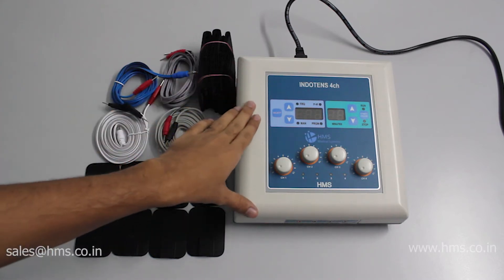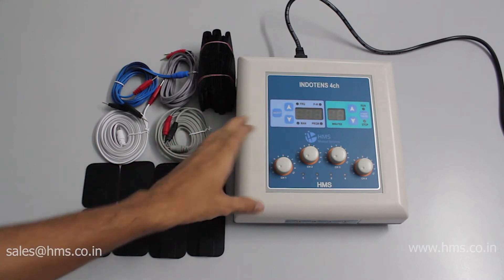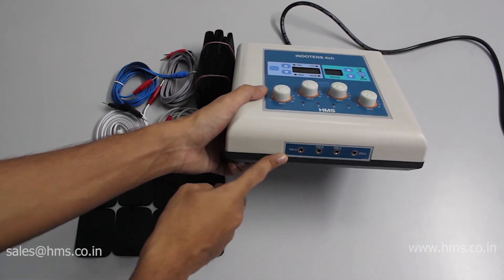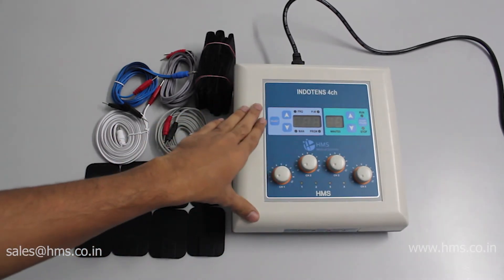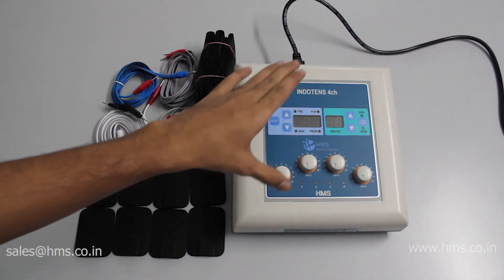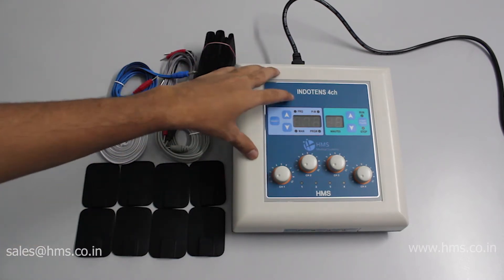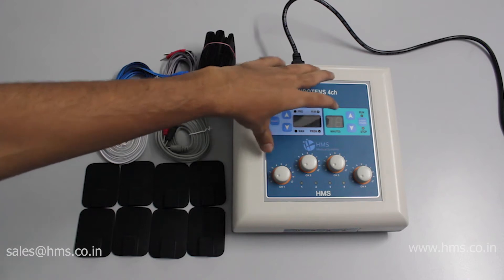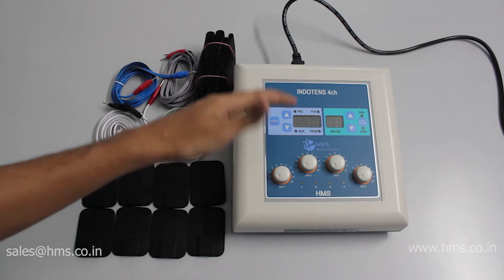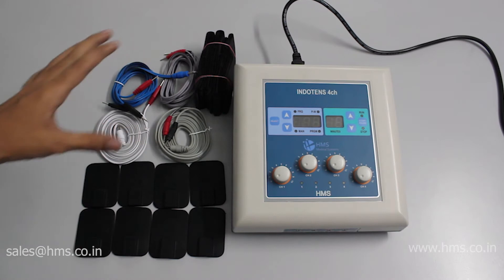This is the Indotense 4CH, a four-channel basic TENS model. As you can see, it has four different channels, which is the main plus point of this device. It also has a total of 10 programs. The first program is a manual program where you can set your own frequency, pulse width, and timer according to your needs. The other nine programs are pre-programmed by default.